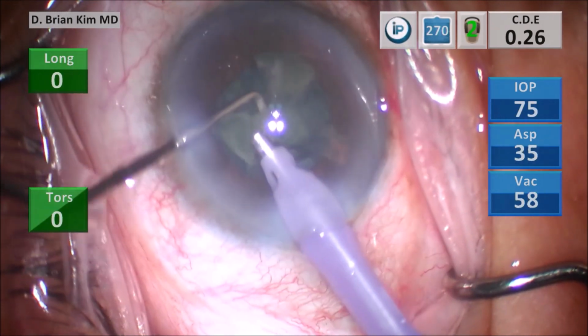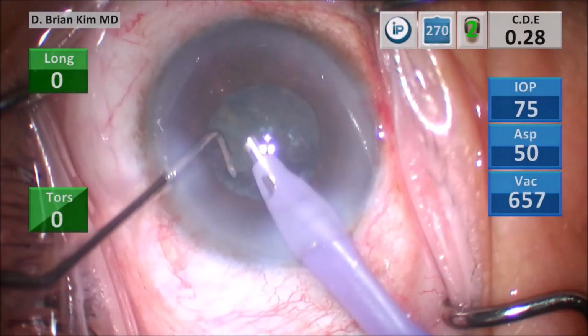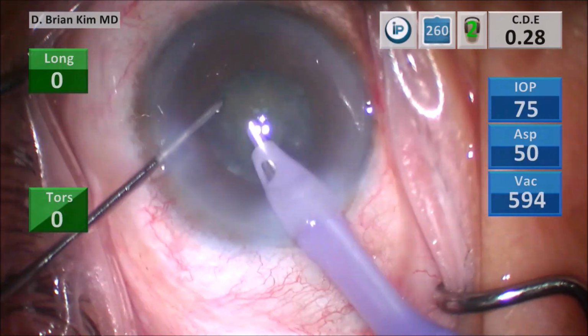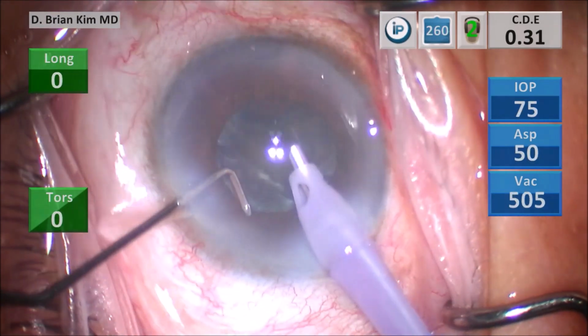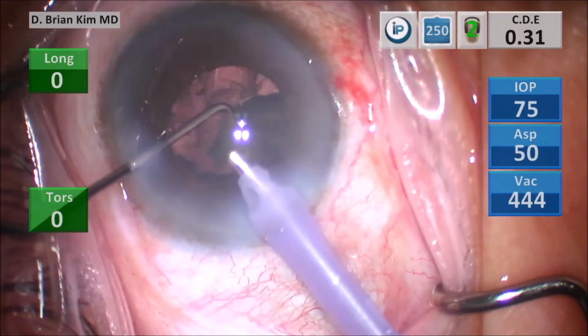So at this point, I have only a few little fragments left. I'm using mechanical forces to crush the lens pieces into bite-sized pieces before I emulsify the lens pieces. And now I'm left with the epinuclear shell. I'm just grabbing the anterior portion of the epinuclear material, and it just prolapses out of the bag. And this is the end of the lens removal.